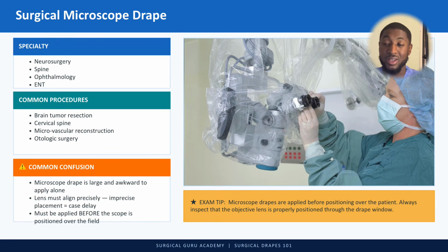I mean, everything kind of does, and whatever you have the most exposure to is what you are going to be the most comfortable doing. It says microscope drape is large and awkward to apply alone. I like to do this with my nurse. That way they can help grab the end of it and pull it for me. But it is very important also to understand how to do it yourself.